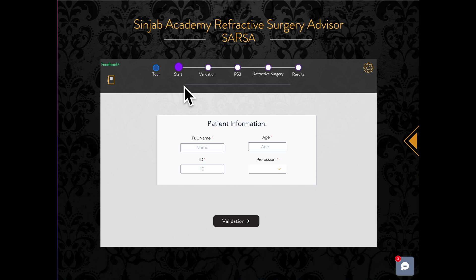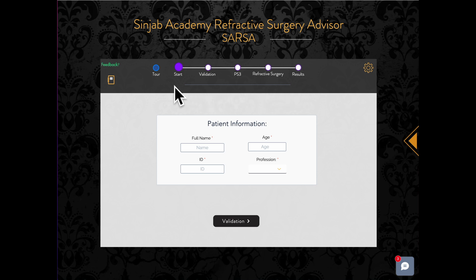In the middle of the toolbar is the process bar that shows the step you are in. When you start a new case, the program will guide you through the steps in order, so you cannot skip over a step.